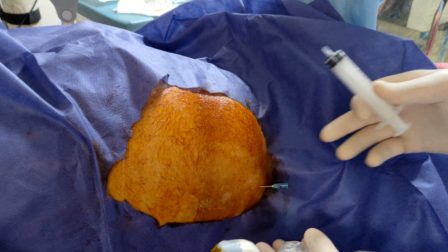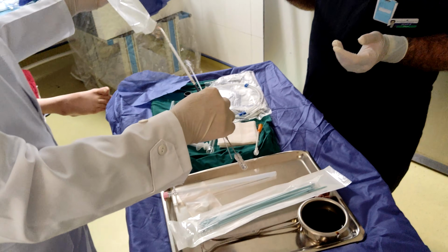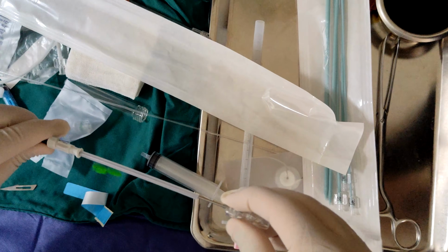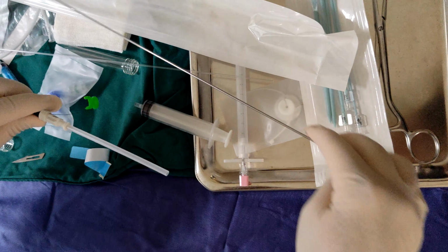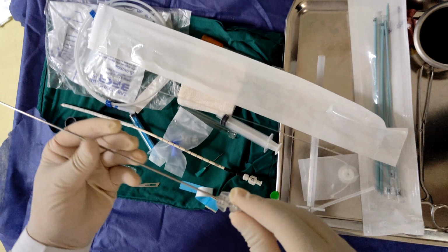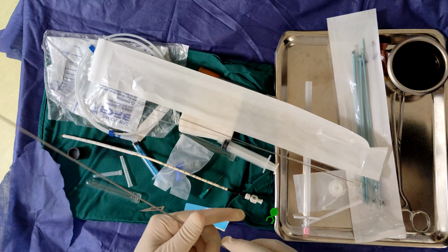Equipment checklist: sterile probe cover and gel, local anesthetic like lidocaine, peritoneal drainage catheter kit, often tunneled or pigtail type, scalpel, dilator, guide wire if Seldinger technique is used, like in this patient, sterile drapes, gloves, and dressing materials.